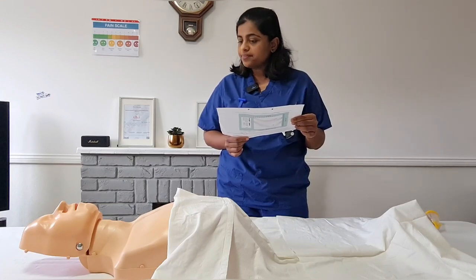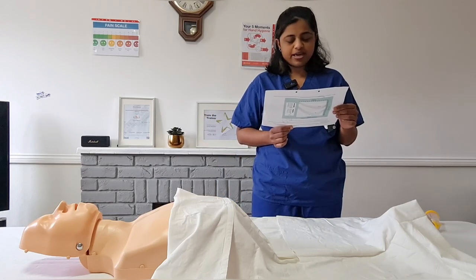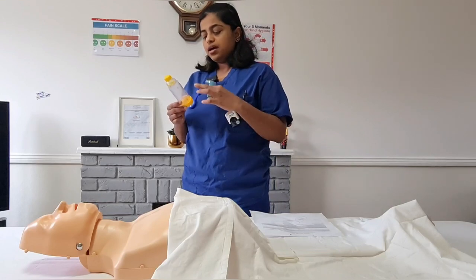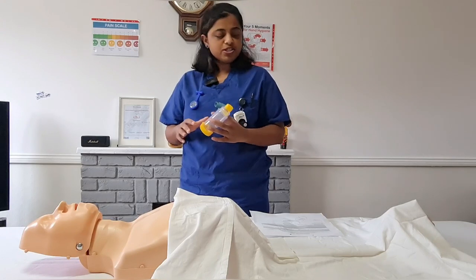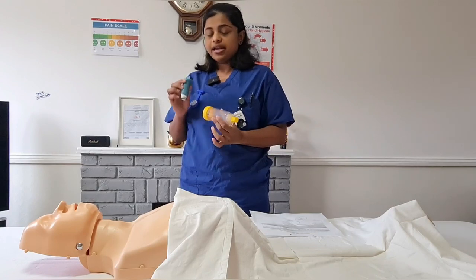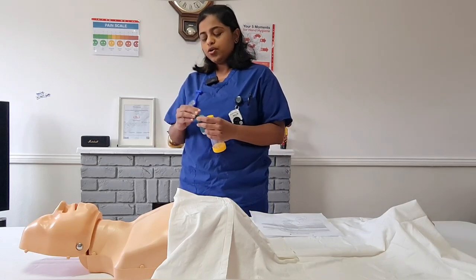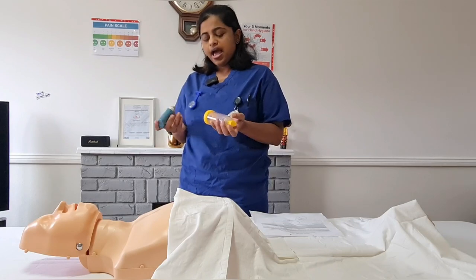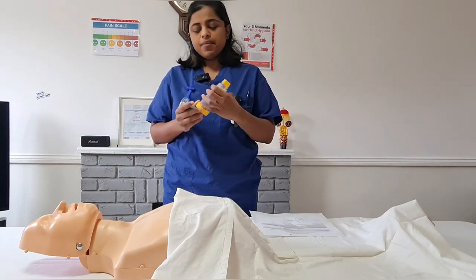Emma, can I confirm — are you allergic to anything? No. Thank you. I have checked the medication against the six rights. Now I am going to give the medication. I have got the spacer device here. If the spacer device is not clean, I will make sure I clean it with warm water. My clean tray is ready. I have the inhaler here. You need to remove the mouthpiece of the inhaler and shake it for two to five seconds like this, then insert the inhaler into the spacer.